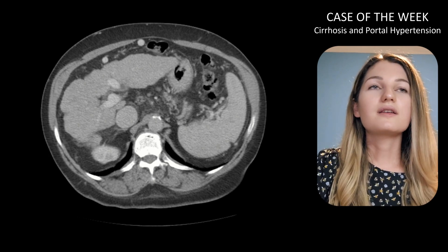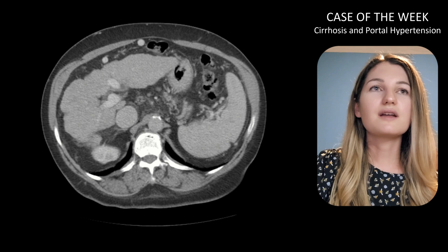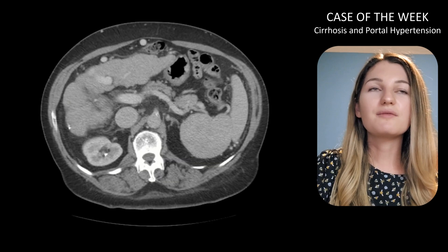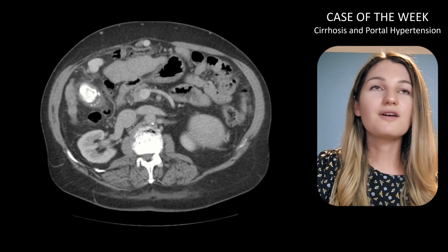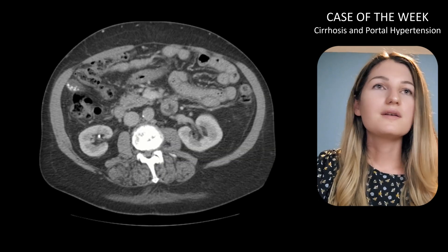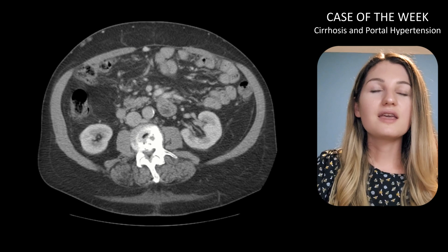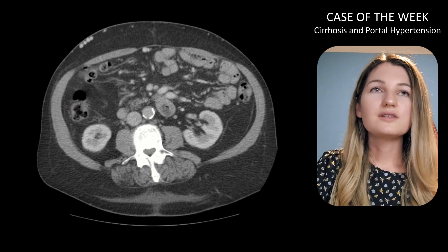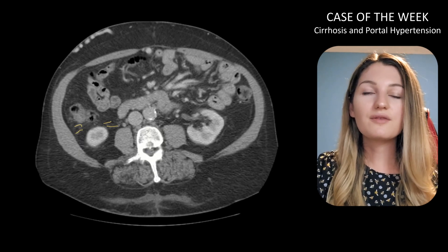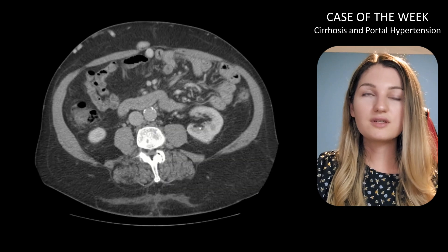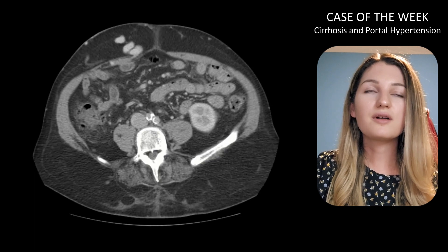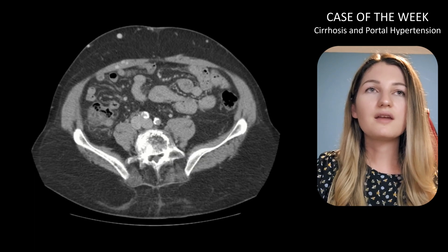We're going to skip over our kidneys, adrenal glands, pancreas, and stomach as those were normal. Scrolling past our gallbladder, it does have quite a few calcified and non-calcified gallstones without any pericholecystic fluid. Continuing down, keep your eyes on the region of the colon just inferior to the right kidney — as we scroll down we see a bit of inflammatory fat stranding around the colon that is just a little too much for normal, and also some mild thickening of the colonic wall — a mildly edematous and inflamed colon.